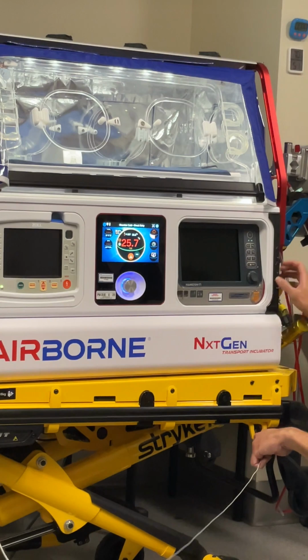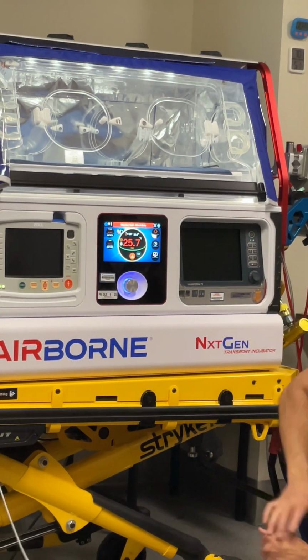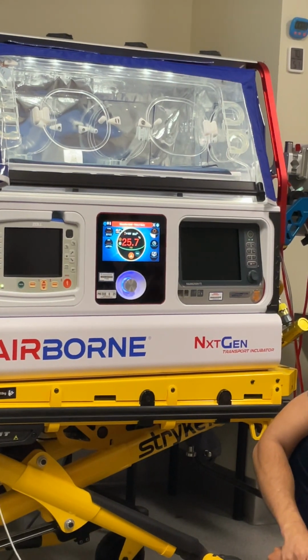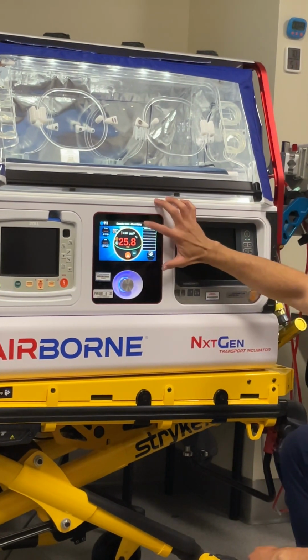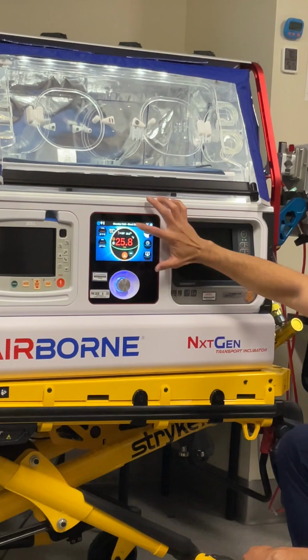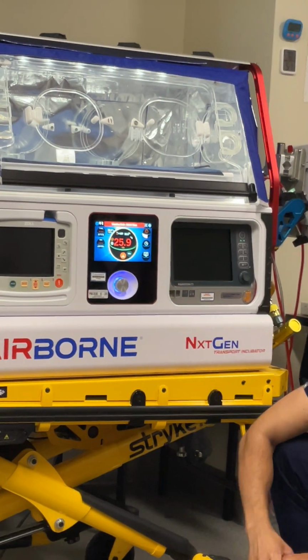So Sherry, you would just set the air temp for charting and the baby temp? Well, you don't have to do all babies on servo. You can do just the micro preemies on servo. But for charting ones, you're going to want what we set it to and what the baby is. Probably, yeah. I would just cross out air on the top and put set. Or servo, yeah.